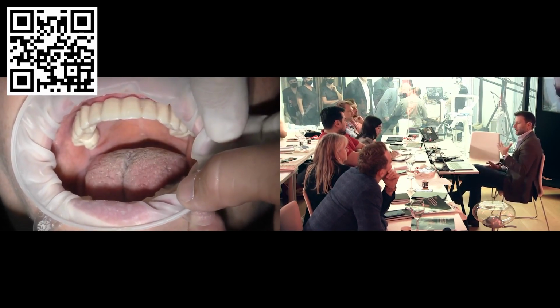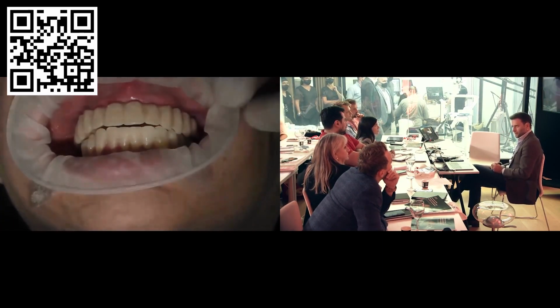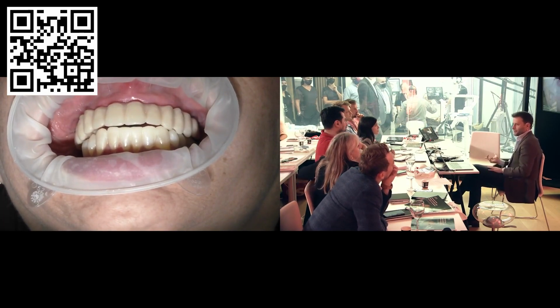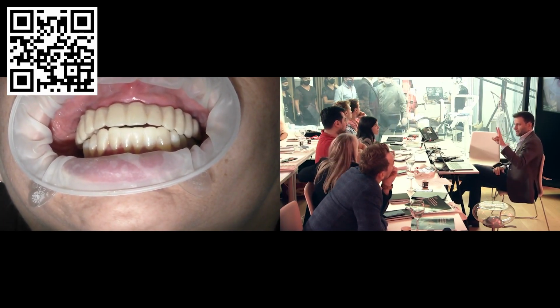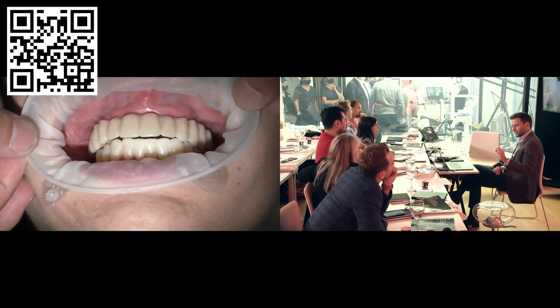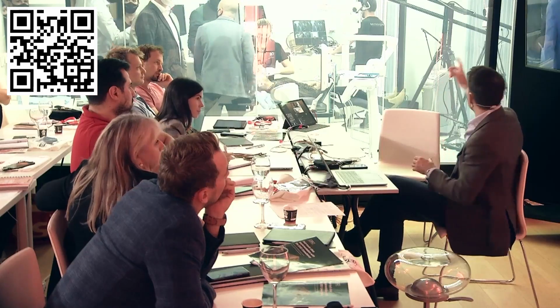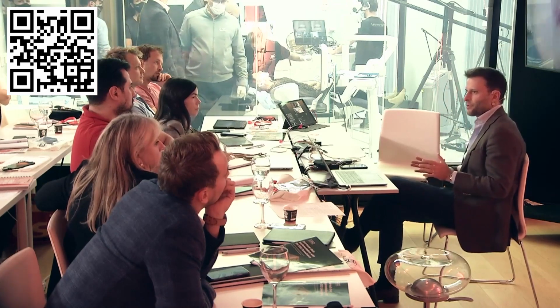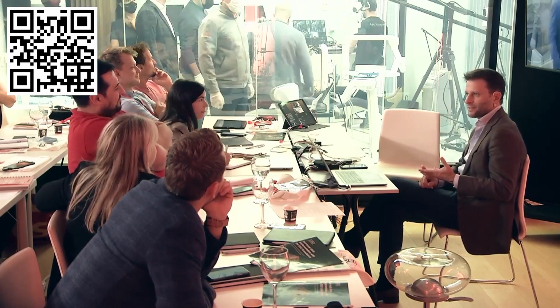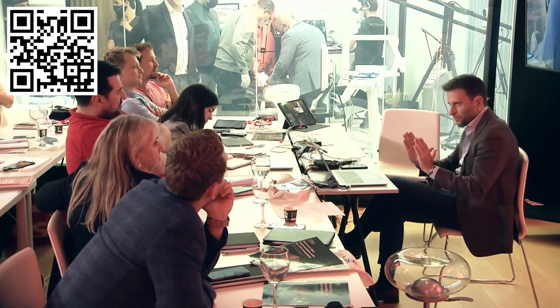So after you send to us the final scan of the implants and you order the final prosthesis, before we manufacture the final prosthesis, we're going to send you 2 things: the functional aesthetic test drive and the passivity test. So you're going to get in the box a printed, inexpensive bridge for you to check the aesthetics, the bite, and the passivity. So you need an appointment just for that.